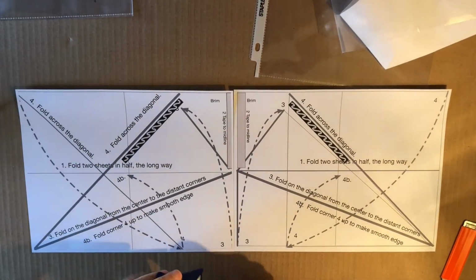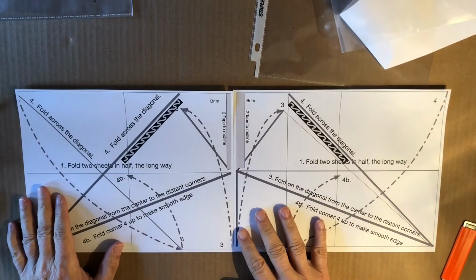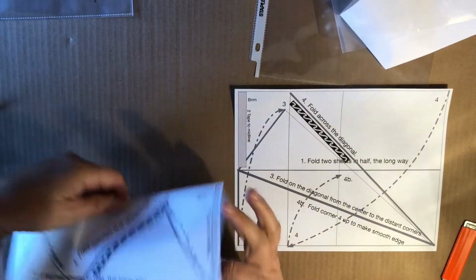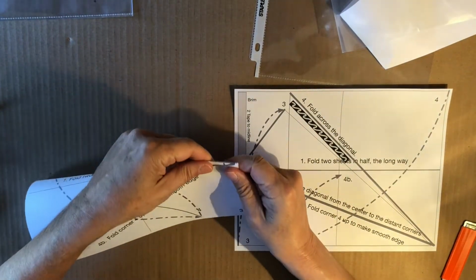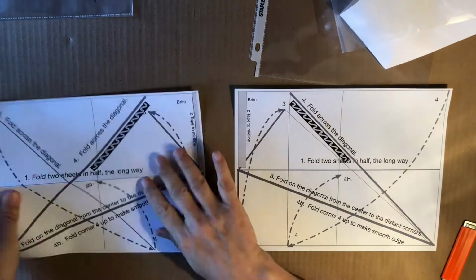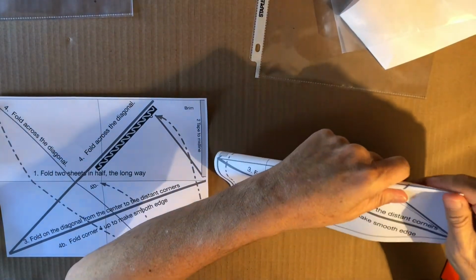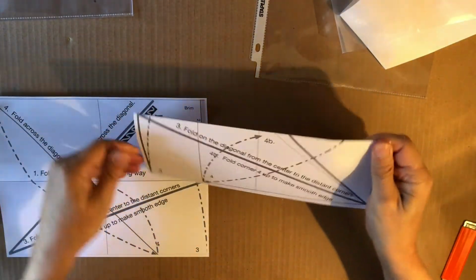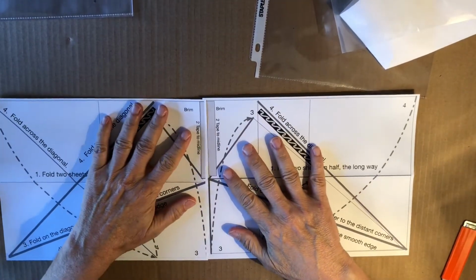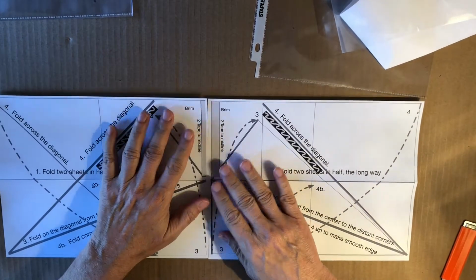non-sterile donated materials. The sheet looks complicated, but in fact, first thing we do is we fold each sheet in half the long way. That's step one. Just to give us a midline. Okay, according to this, step two is to tape to the midline, meaning from here to here.